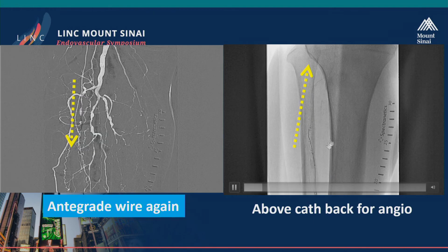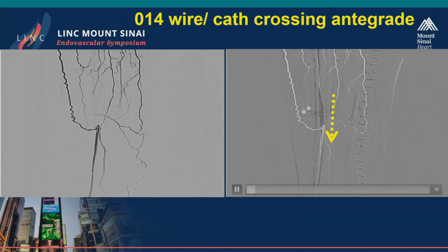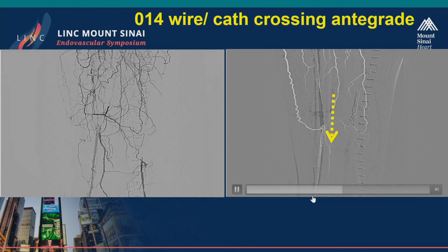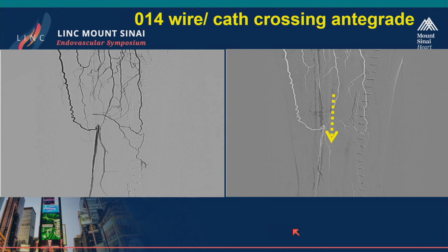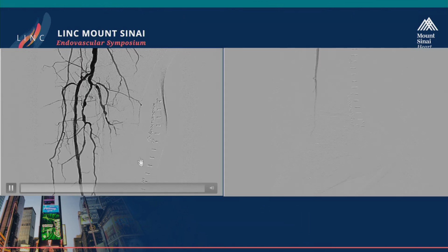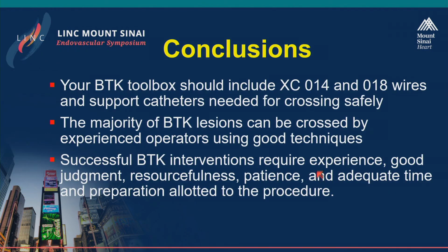Before we do CART with a small balloon, one of the things you can do is simply try, now that you've made a channel up here, to antegrade wire and have the wires meet. And now we're able to get a wire antegrade, just facilitated by crossing from below with a catheter, confirm our position. And here are drug-eluting stents in the anterior tibial and result.